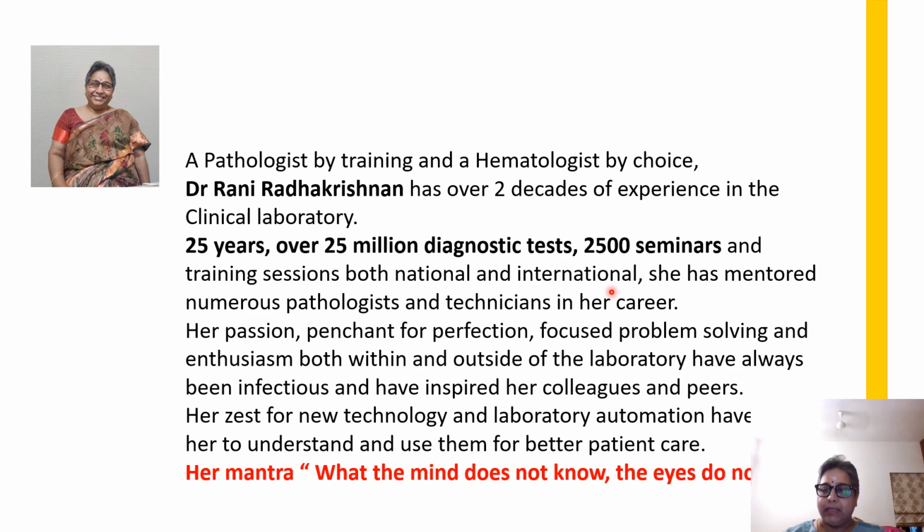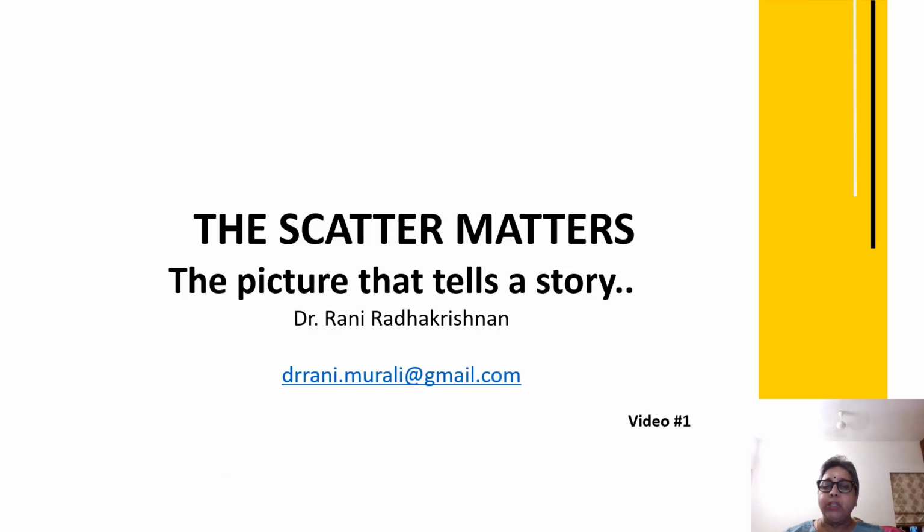This is a series which we shall call the scatter matters, because I truly believe that the scatter of cells that we see on cell counters tell us a story that is beyond the numbers that are provided in the report by the cell counter, or for that matter, in the reports that we give out to our patients as a complete blood count report.